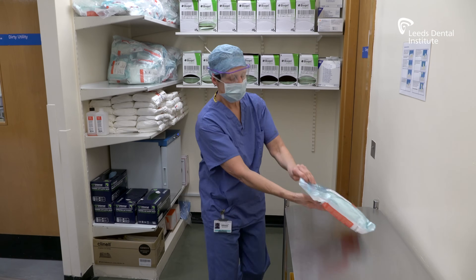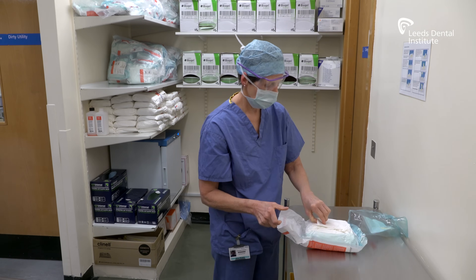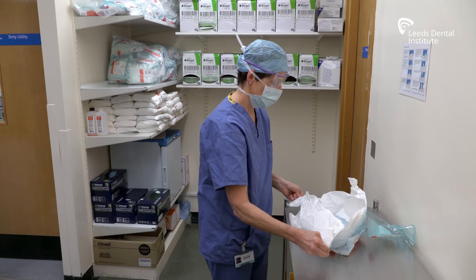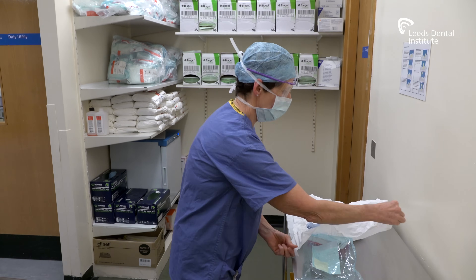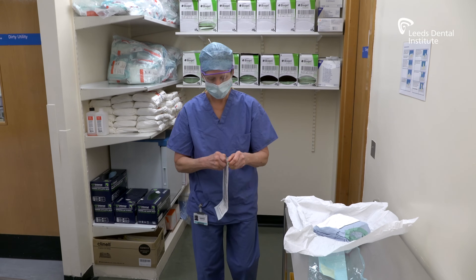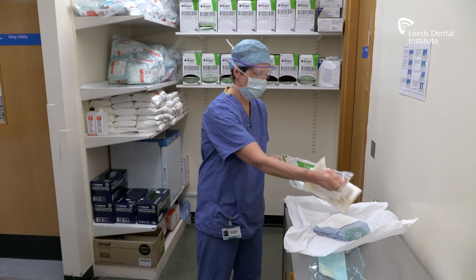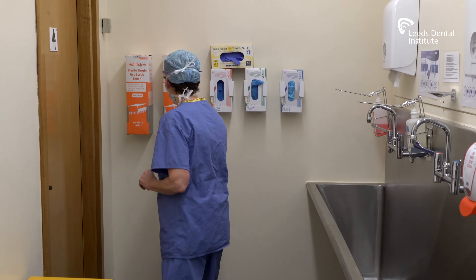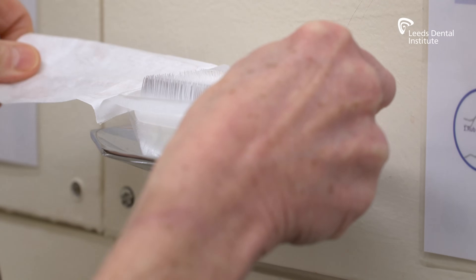If you need to open your own gown prior to scrubbing, do so by opening the outer wrap first and then carefully open the inner wrap to avoid touching the inside of the wrap or the gown. Once opened, you will need to drop your sterile gloves onto the inner wrap next to the gown. You will then need to prepare for your surgical scrub by opening the scrub brush prior to wetting your hands and place it on the side.